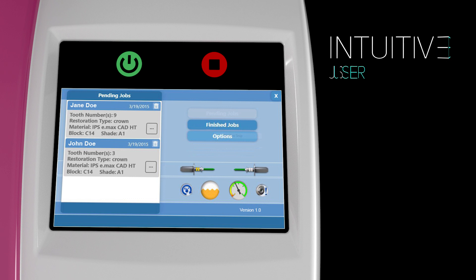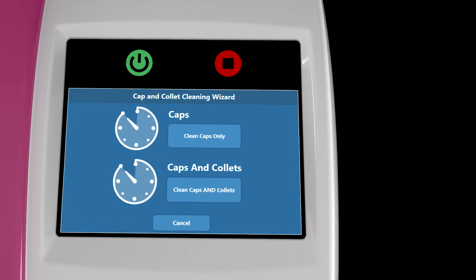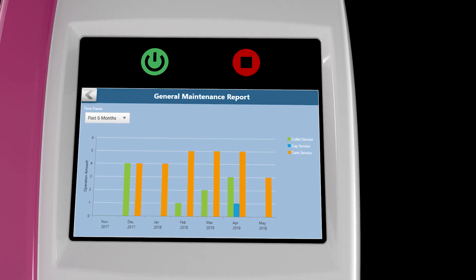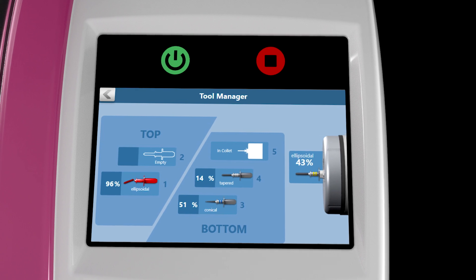An intuitive user interface with smart software streamlines the user experience through updates on system maintenance, alerts, reports and tool status to notify you when the mill needs attention.